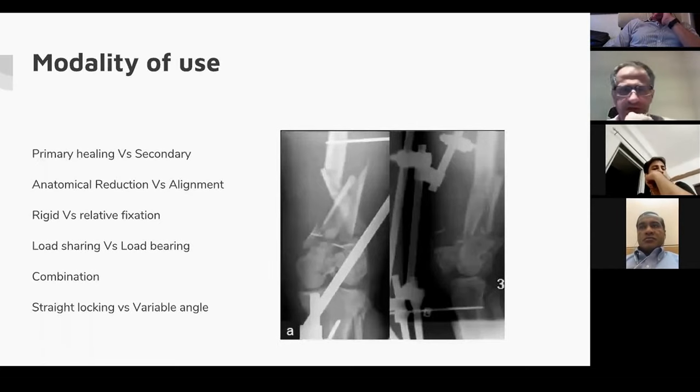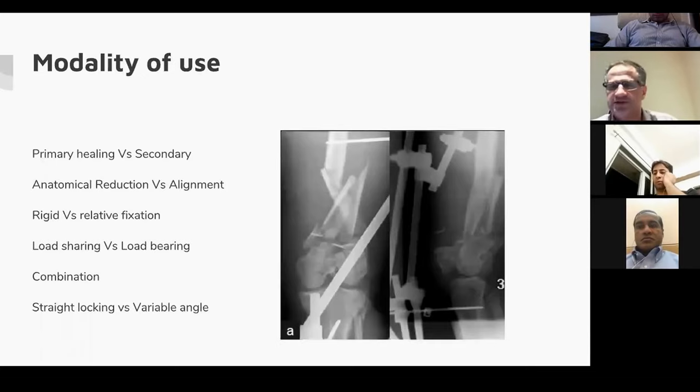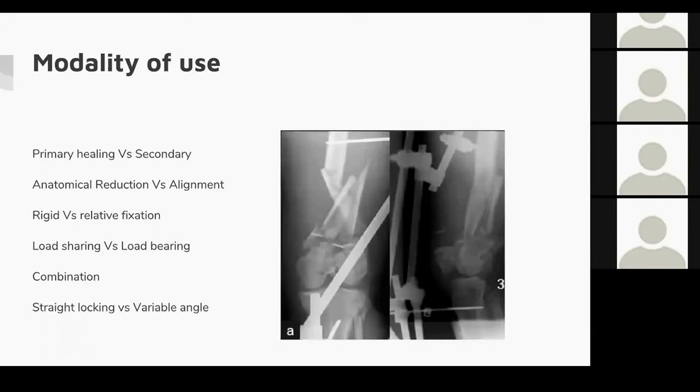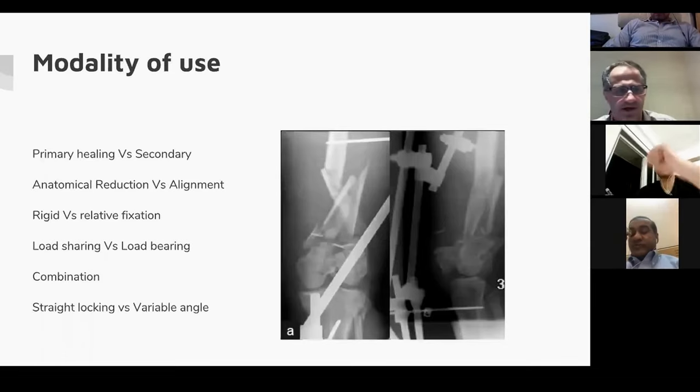The first thing you should always say is, presuming this patient has been assessed and this is an isolated closed injury, or if they tell you it's an open injury, just assume that, and the patient is neurovascularly intact in a fully consented and draped patient, my positioning is... From there say my intention of fixation will be this, how I will achieve my goal of fixation is Y, and how I will maintain that fixation is length of the construct.